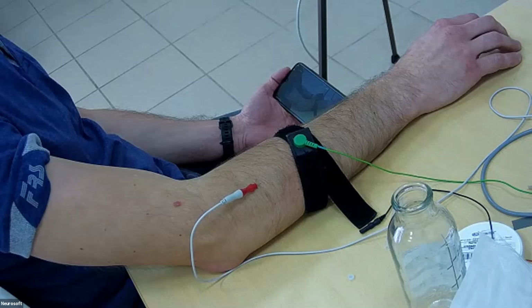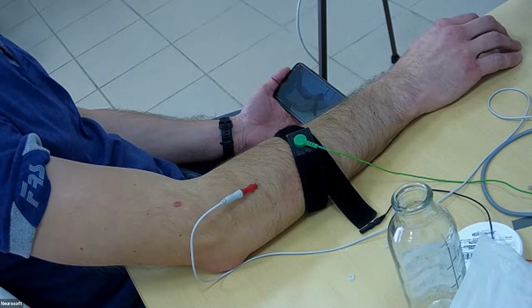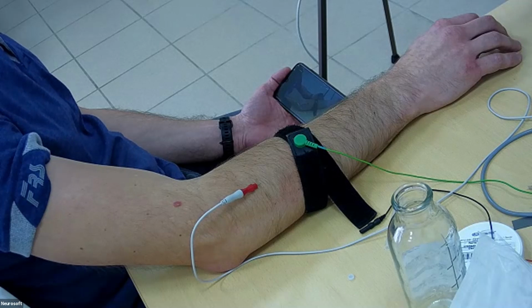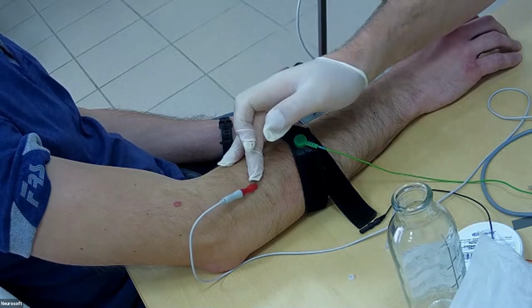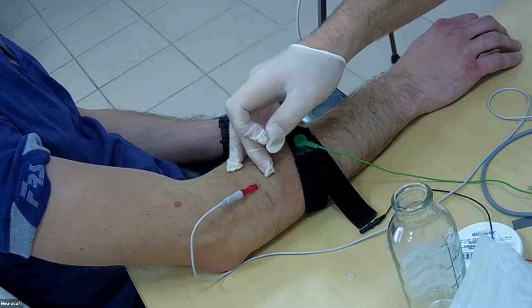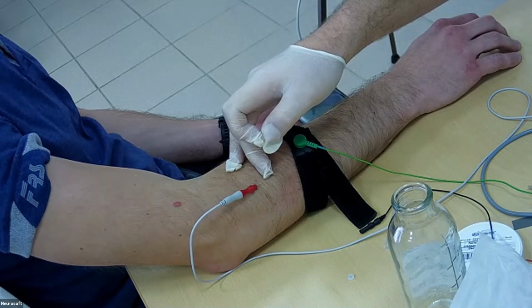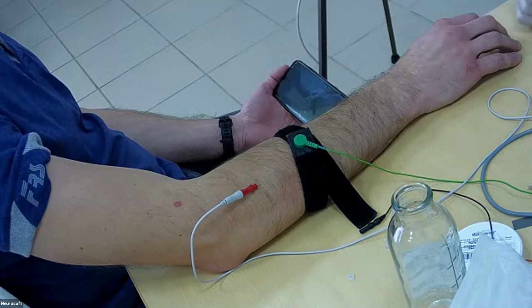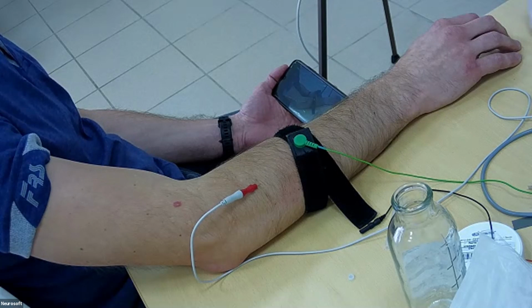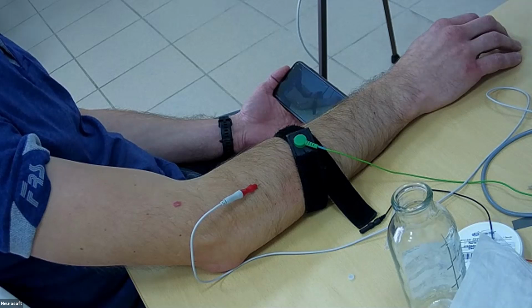In the first channel, we will register activity between the core and cannula of the concentric needle, and in the second channel we will register the active electrode, the cannula of the same concentric needle, and the second will be a surface electrode near this.